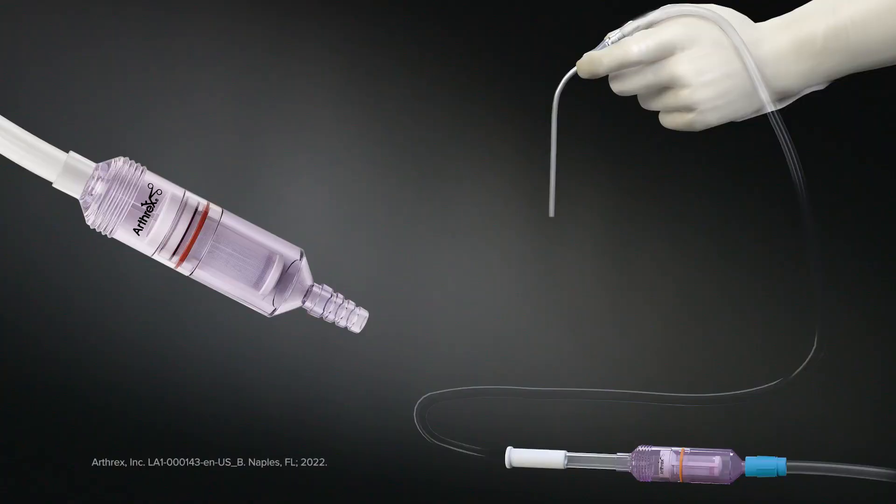Studies have shown that the bone chips created through the use of a high-speed drill have good cell viability. The type of burr has a direct effect on cell viability, thus we recommend using a cutting burr with as few flutes as possible to maximize cell viability. A collection of bone chips created through the use of a diamond burr is not recommended.